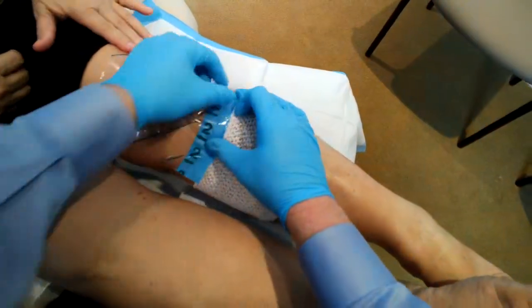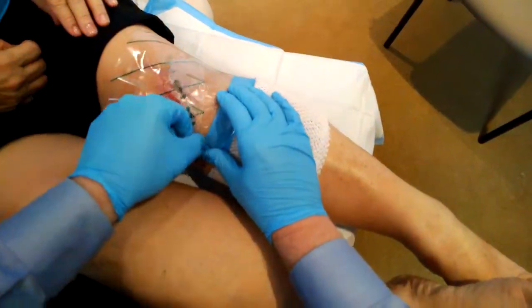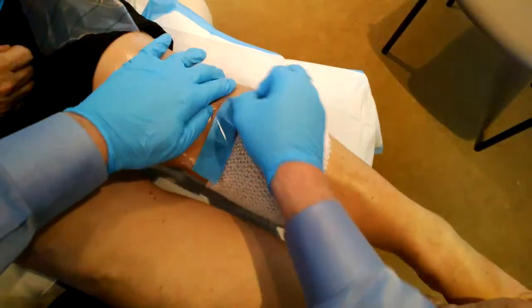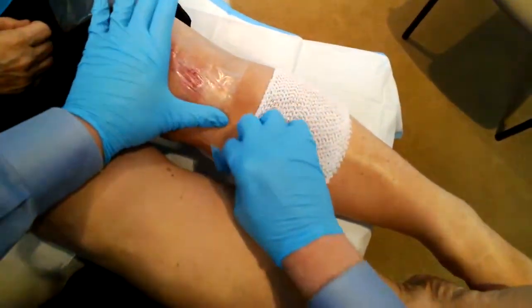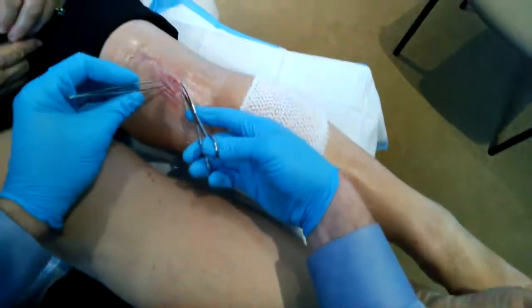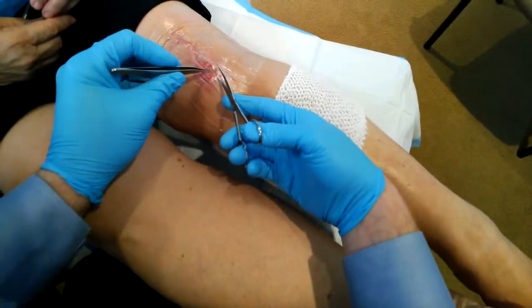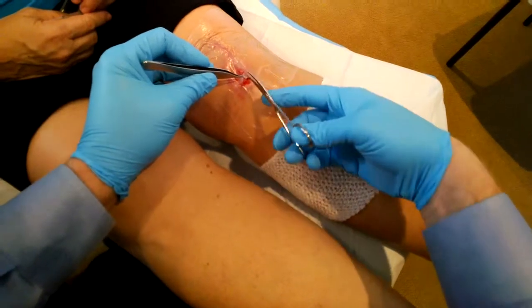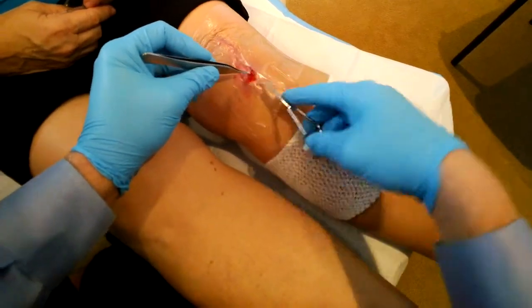Now we're going to have this seal on the skin. We want to protect the normal skin and put the sponge just right onto the wound itself. I'm just going to take some scissors here and cut a little tiny hole in the sticky drape just where the wound is, so that we have a window into the wound, thereby just protecting the normal skin.